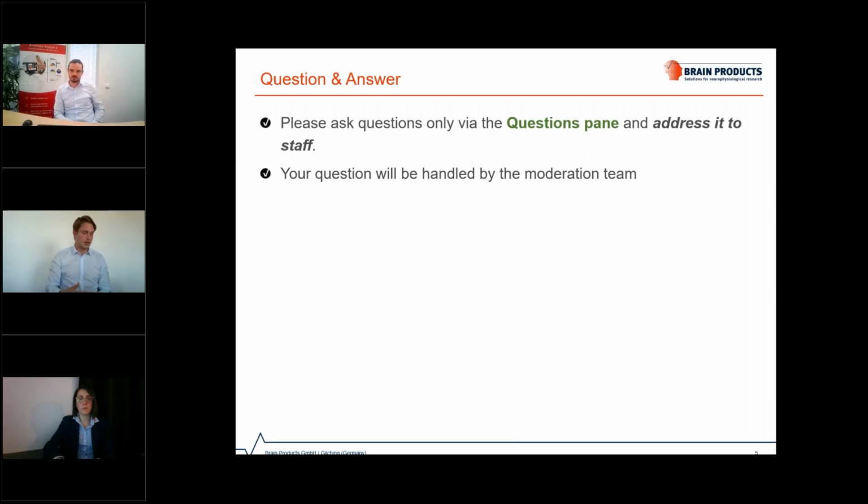So I'm not sure what kind of results you will get with this electrolyte cream, but it's definitely a very interesting question, and I'm going to look it up and get back to you if possible. We're going to note down the email and follow up at a later stage after the event is finished. So thank you for the question.